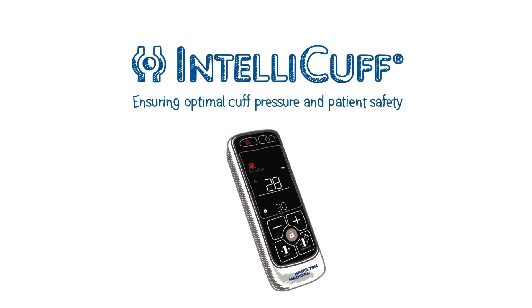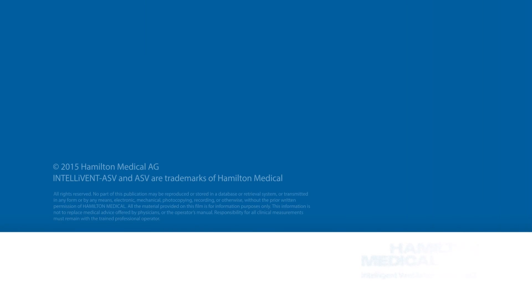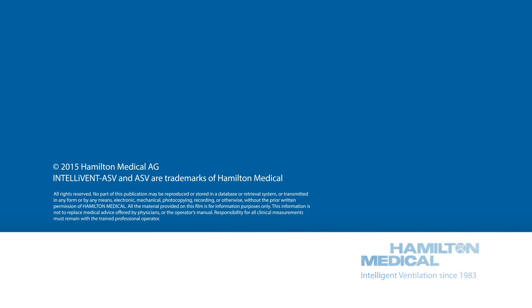IntelliCuff — ensuring optimal cuff pressure and patient safety.